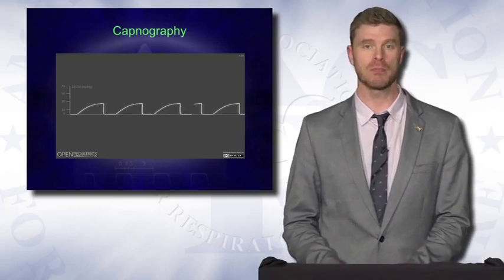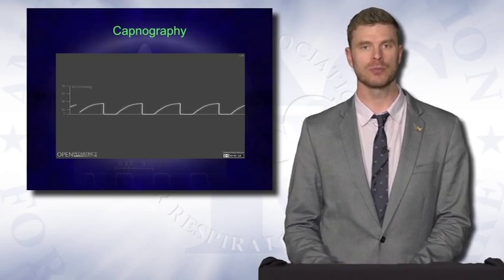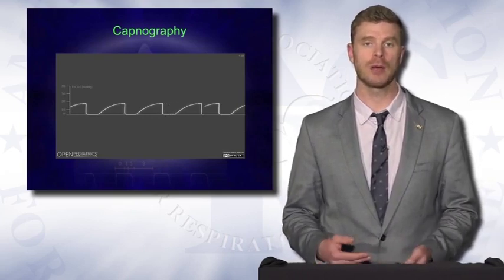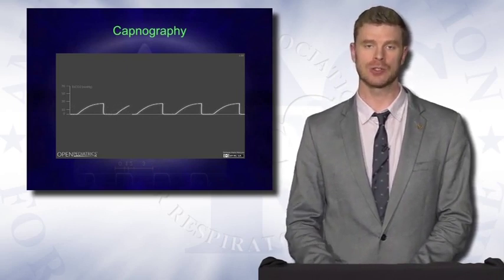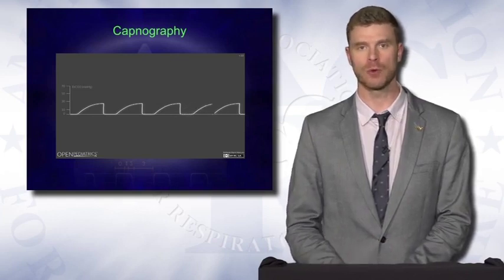These types of patients may or may not have a phase 3, and typically with moderate or severe obstruction, we will not note a good plateau. It's also noted that in patients with anatomic obstruction of the large airways or conducting airways, the gradient between PaCO2 and end-tidal CO2 is going to be larger in a patient if you notice this type of waveform pattern.